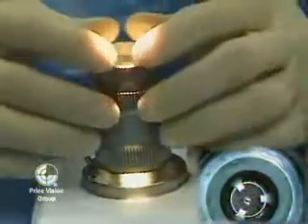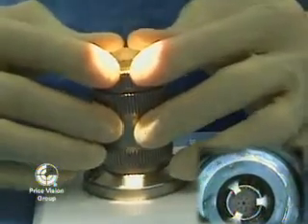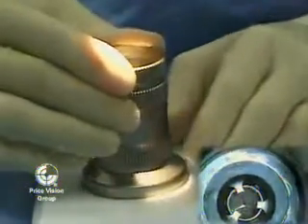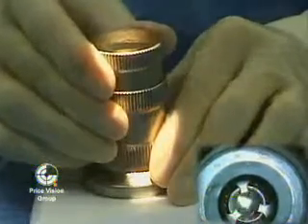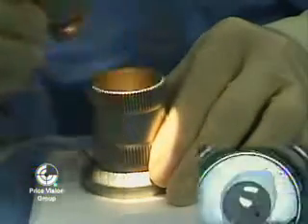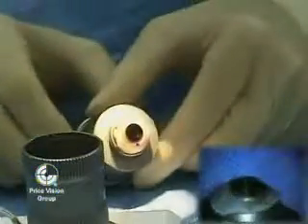This is a very elegant system for creating a very centered cut of the donor, which is very important when we have made a resection. It's only about 1 to 2 millimeters in diameter larger than what we're going to actually harvest and put in the patient's eye.